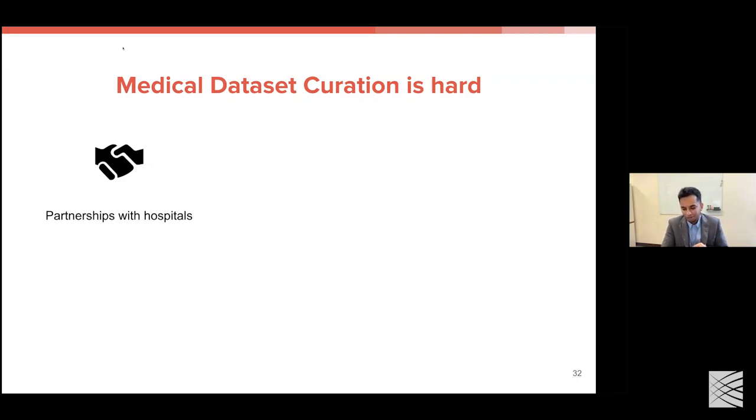Fun fact I should mention. For the head CT example I showed, where we had a model ultimately segment aneurysms, on the test set, that was done by a board-certified neuroradiologist, and I think it was actually a pair of them. On the training set, it was done by a group of two master's students in computer science who learned off the internet and through spending two-hour-long sessions with the neuroradiologist on how to go about this task. And I remember there was a weekend where they were just playing some music, had a monitor, and were just labeling these scans. So different sources, but often not the same as what's used for the test set.